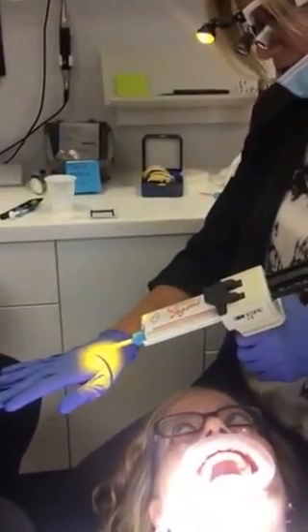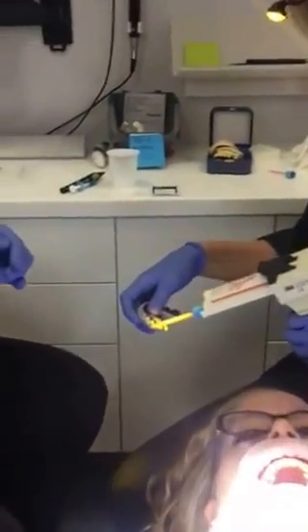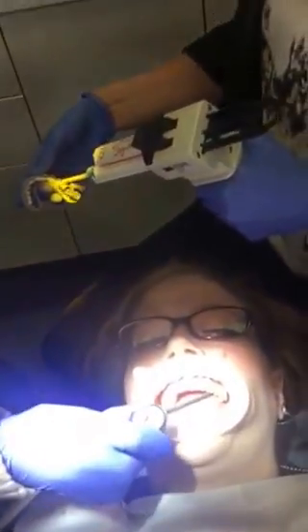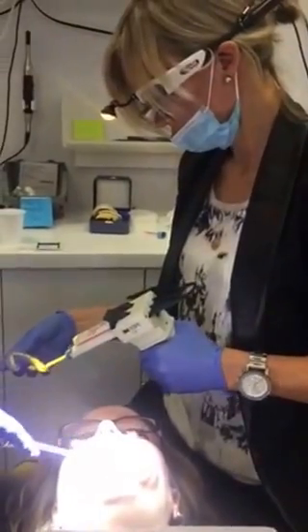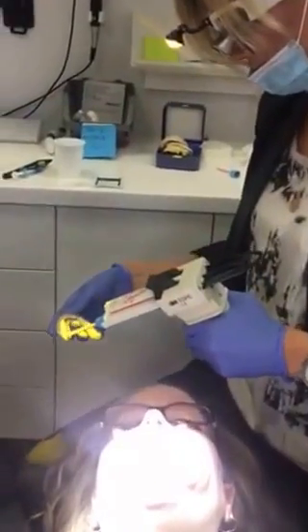We're going to give a little bit of dryness on her teeth — we're gonna dry her teeth as well. Slowly fill this; I'm gonna fill the contact areas a little bit more than we would the other. It's gonna be a little bit of excess — you're gonna feel it and we'll get it off in the back of your throat.